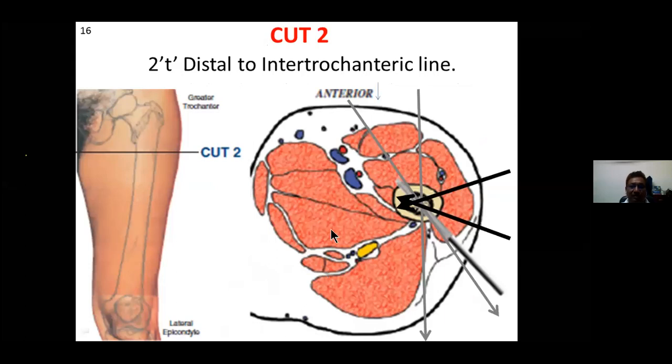In this cut, transfixation pins are restricted to the lateral half. Lateral half only. The wires can be placed from above downwards and from here to there, but it is more cumbersome for the patient to bear the wires here due to muscle attachments. So here also half pins are advised.